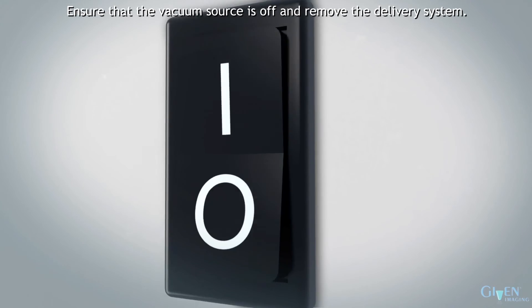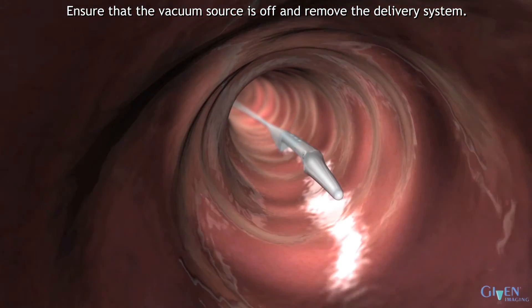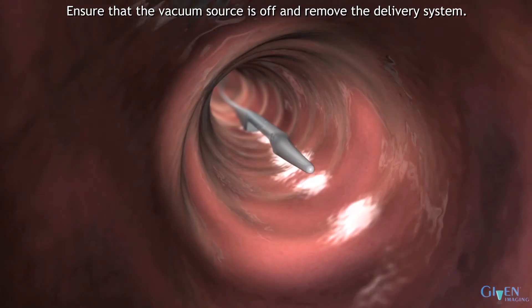Ensure that the vacuum source is off and remove the delivery system. Discard according to local waste management regulations.